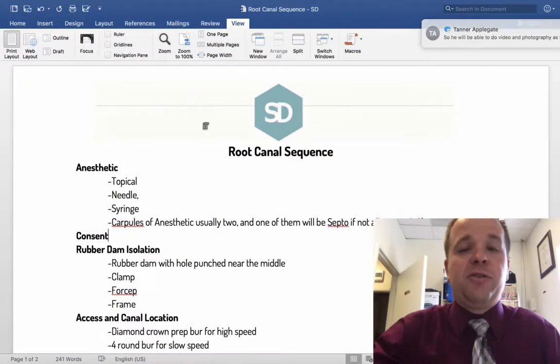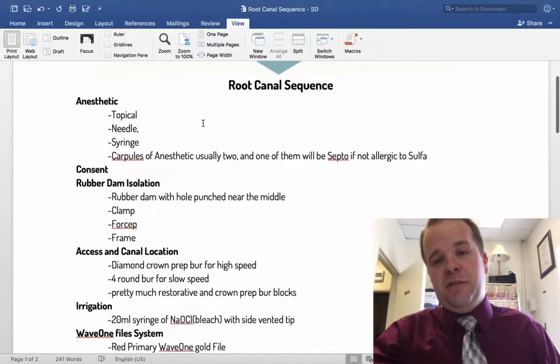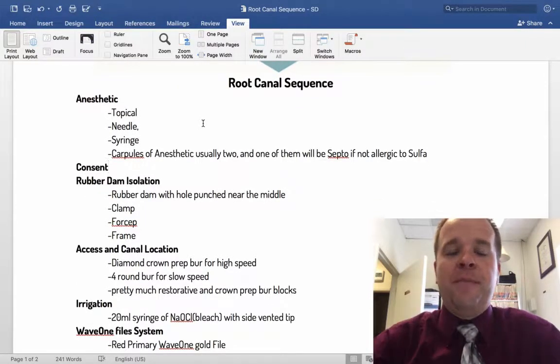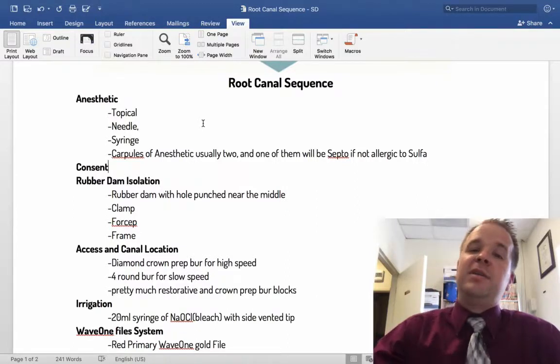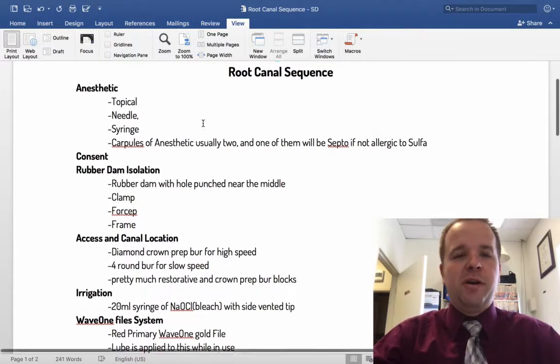All right, root canals are one of the longest procedures that we do in dentistry. They just take a little bit of a while. They're a lot of detail work, and because of that, patients fall asleep a lot because it's really boring for them. But typically, this is the sequence of how a root canal will go.